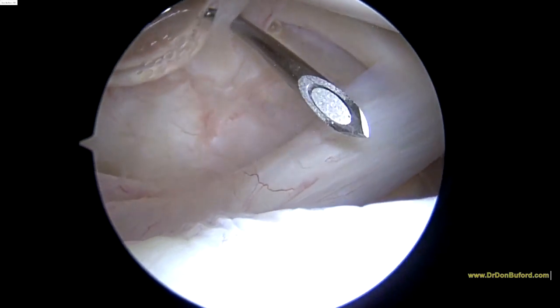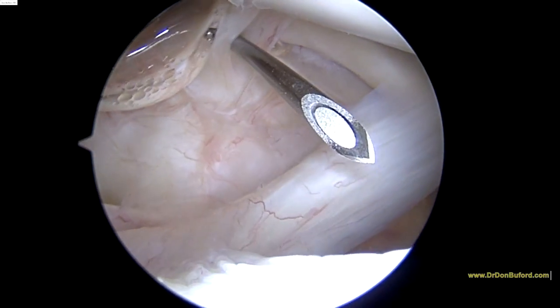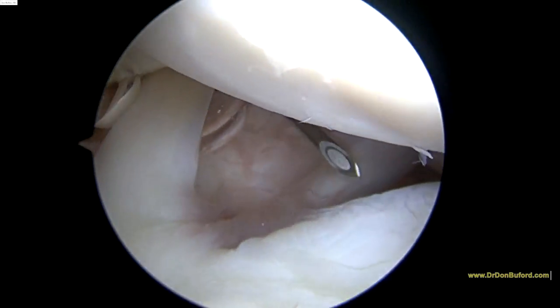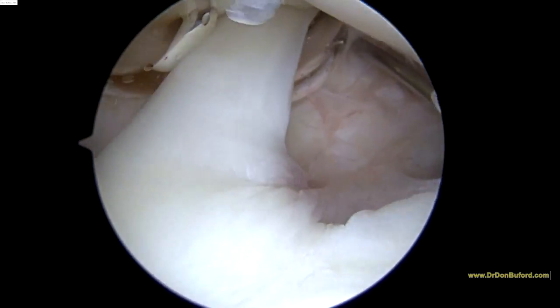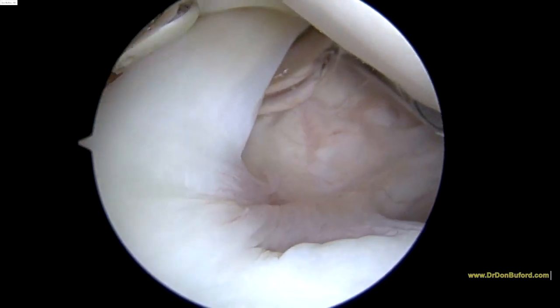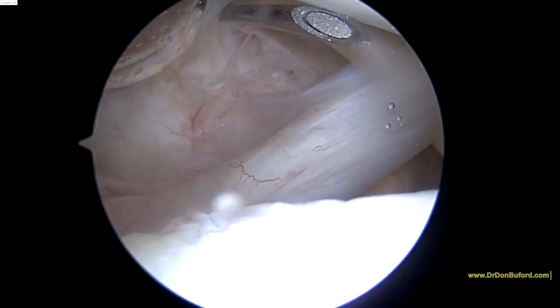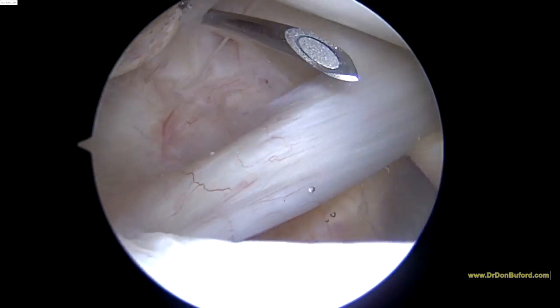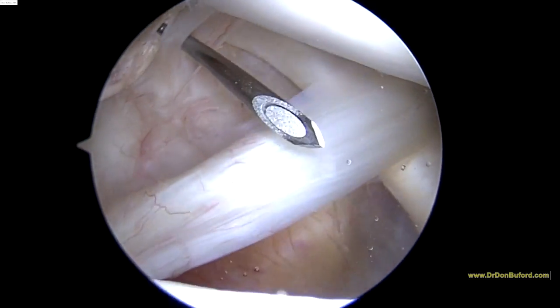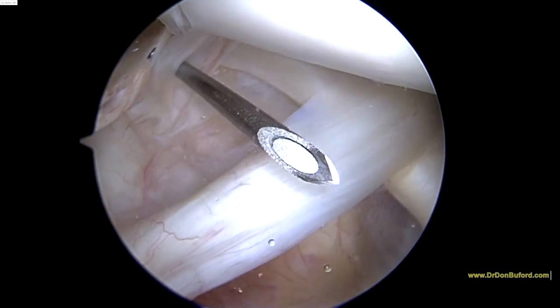Hi, this is Dr. Buford. We just wanted to do a little anatomy evaluation. This is a right shoulder. This patient is in the lateral decubitus position, and we just have a real good shot of the anatomy in the anterior superior quadrant of the shoulder.